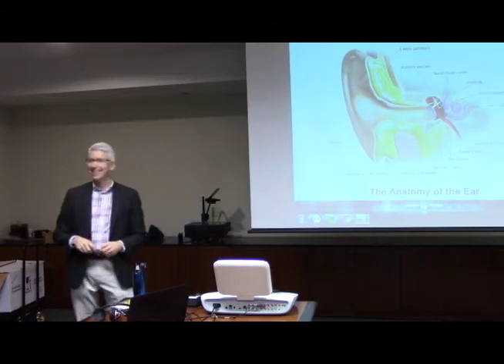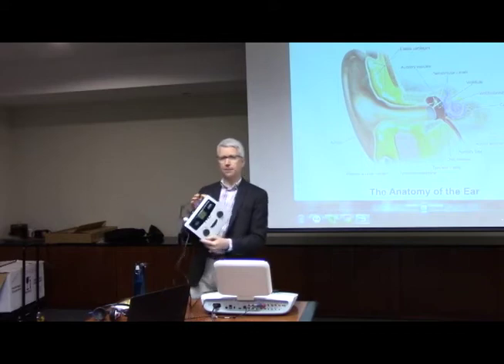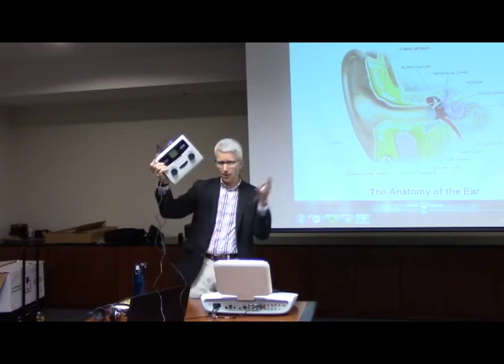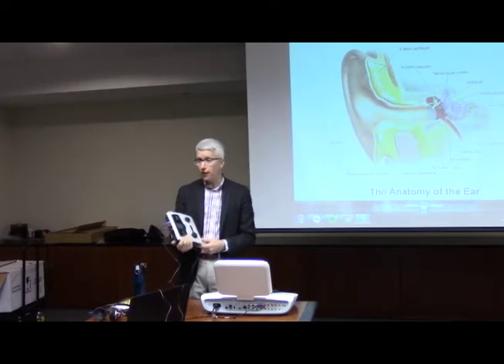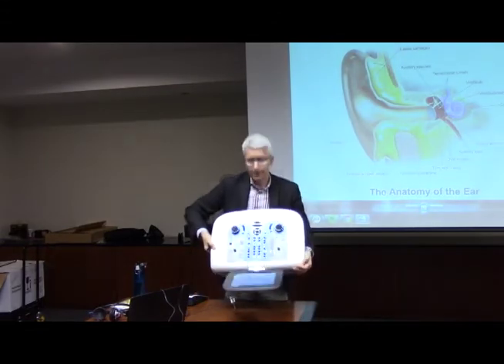Yeah. David, that's a 608 or? This is an Interacoustics AS608 right here. Tiny little thing. I didn't grab batteries for it, or I'd pass it around, but it is battery operated. Like I said, you guys can come up and take a look at this stuff afterwards. So this has a total of 7 buttons on it. Very simple to use, whereas this, which is a little bit different, has a lot more buttons.